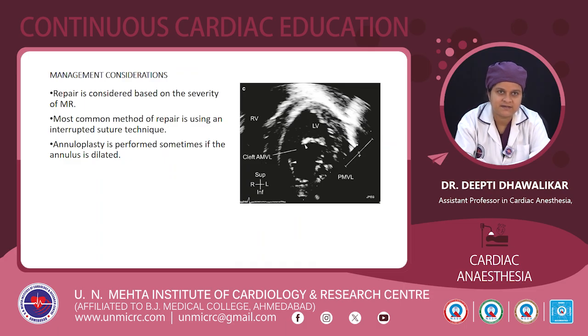Management considerations. Repair is considered based on the severity of MR. Most common method of repair is by using interrupted suture technique. Annuloplasty is performed if there is dilatation of the annulus. So this is again a transgastric basal short axis view showing AML and PML. So you can see a cleft in the AML.